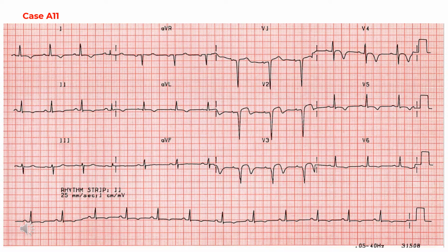Clinically, an ECG like this indicates a recent, but not in the last few hours, myocardial infarction. These patients should go for PCI, but there may be less urgency in doing so as compared to the hyperacute changes of AMI seen in other cases. The patient should be managed as an ACS patient with aspirin, antiplatelet agents, and low molecular weight heparin according to local guidelines.